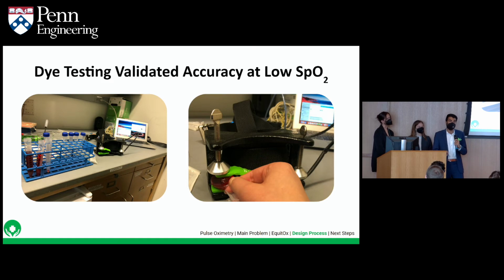With this, we were able to verify that the most sensitive part of our device, most likely to fail, was the red sensor, and it was still able to hit limits of quantization at 60% SpO2 readings. For context, below 80%, we see vital organs start to fail, and below 70% is almost deadly without immediate intensive medical intervention. So we're really able to accurately encompass the entire range of potential human SpO2s, whereas current devices do fail around that 85% mark and below in accuracy.